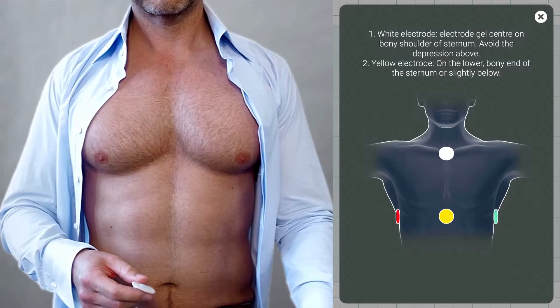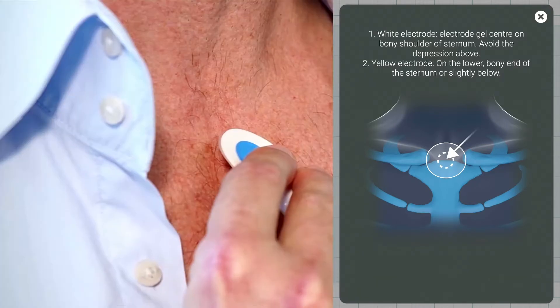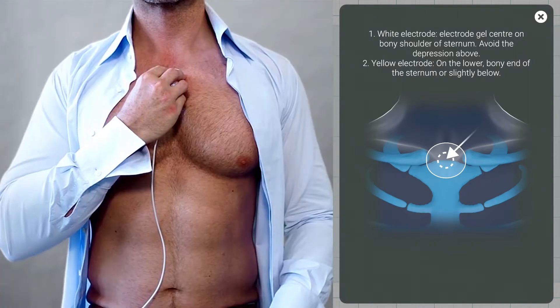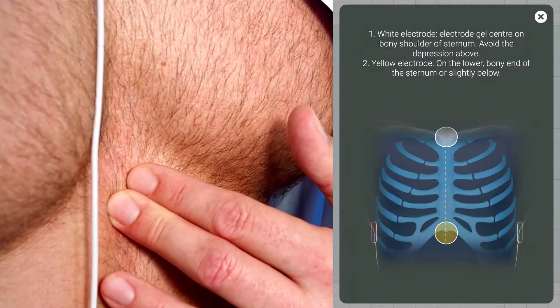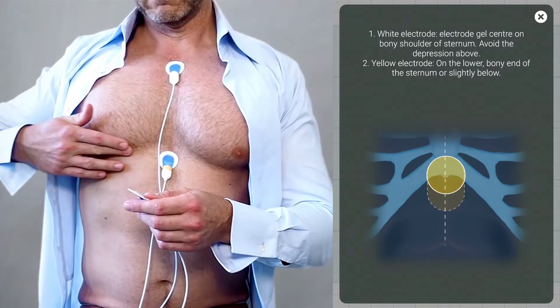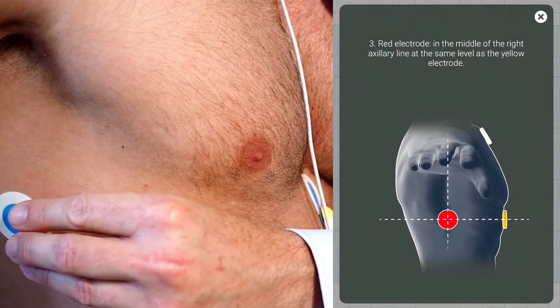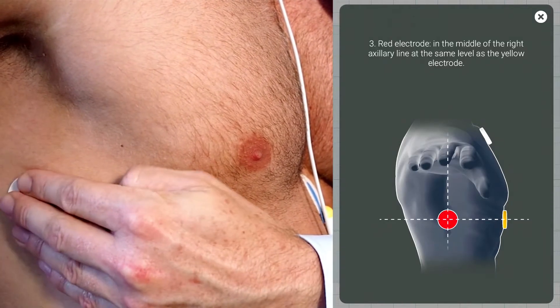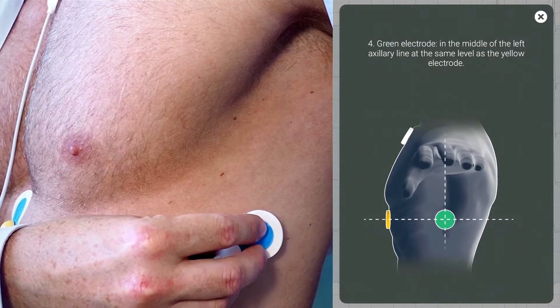The app will guide you through the placement of the four electrodes. Place the white electrode on the upper bony end of the sternum — avoid the depression above. The yellow electrode on the lower bony end of the sternum. The red electrode in the middle of the right axilla, and the green electrode in the middle of the left axilla.